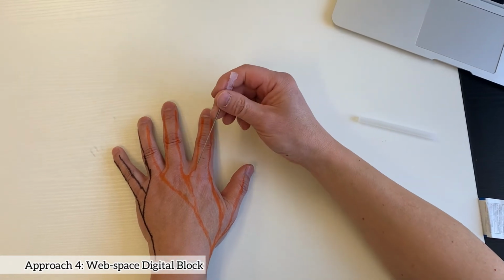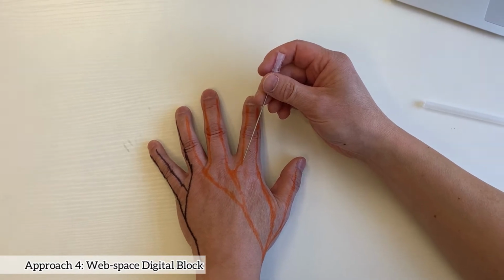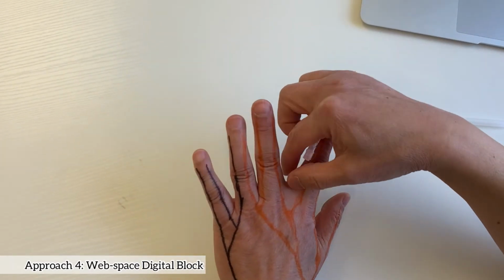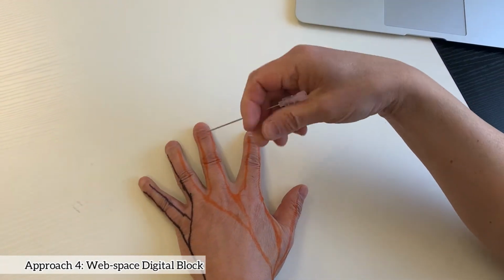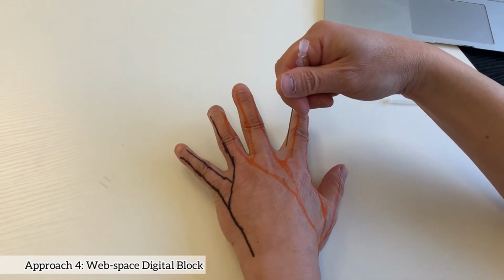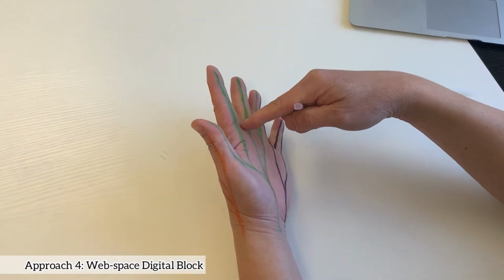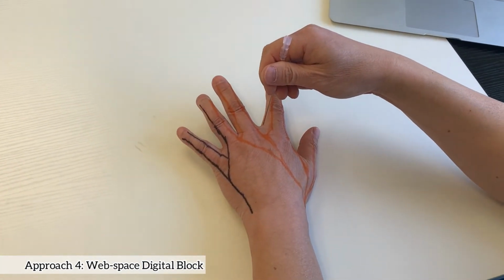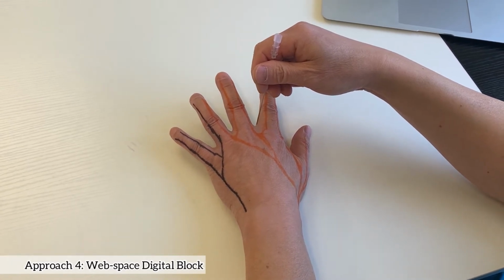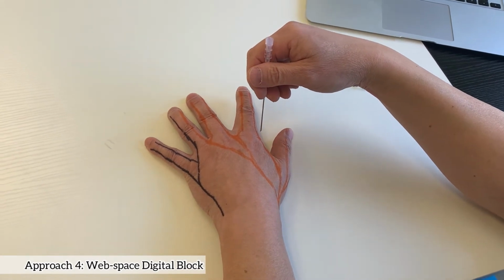Okay, now I'm going to talk about the web space block. First, I'm going to talk about the traditional web space block. So you insert the needle at 90 degrees at the web space. This is the web space, okay? Web space, 90 degrees perpendicular, but try not to pierce the volar part with the needle. Inject local anesthetic, withdraw the needle, inject local anesthetic. The same, then inject in the same fashion on the other side of the finger.